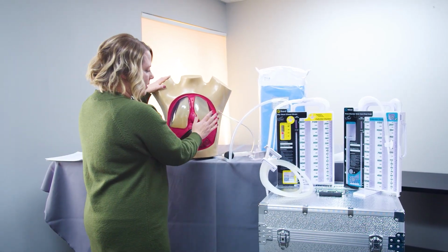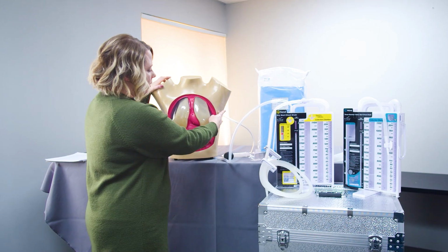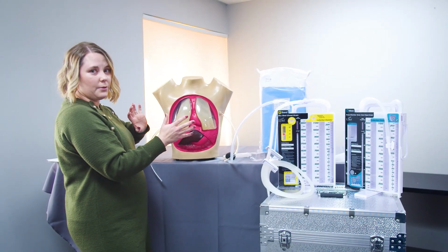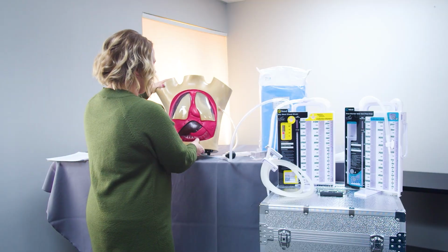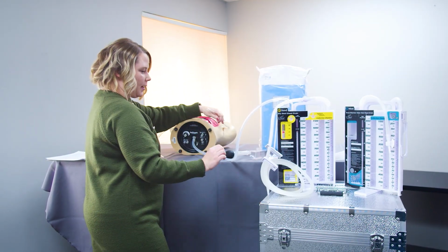And then on the right side of the torso is the pneumothorax simulation. So this one has a higher insertion point, and we can choose to pick either one of these that we're going to use for the simulation. Let's say for this instance, we're going to use the pneumothorax side.